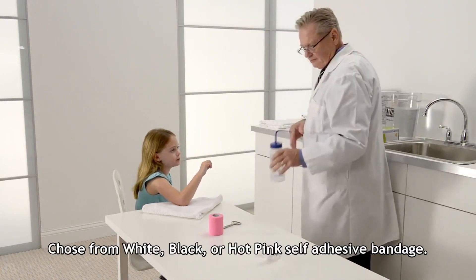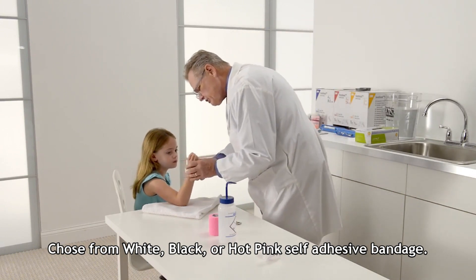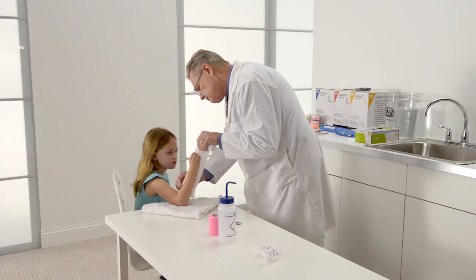Let's get started. Select an appropriate width of the 3M splinting material based on the size of the patient's wrist. Material that is about one inch wider than the patient's wrist is a good rule of thumb.